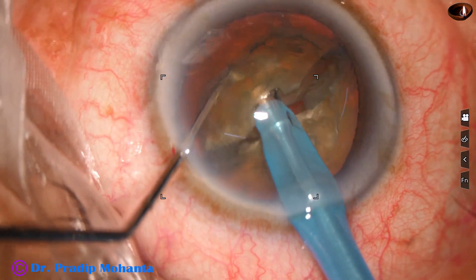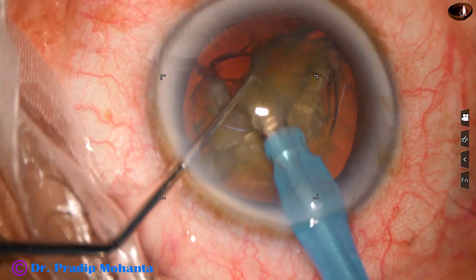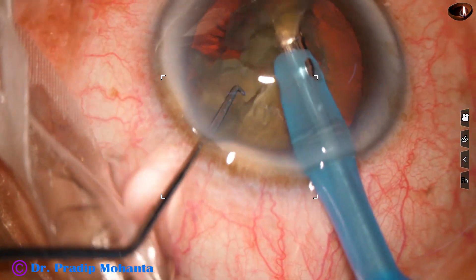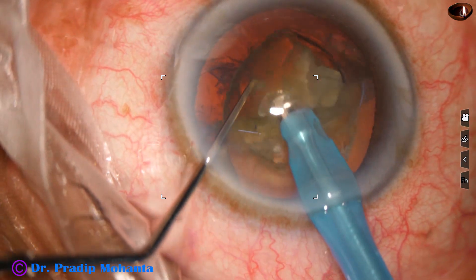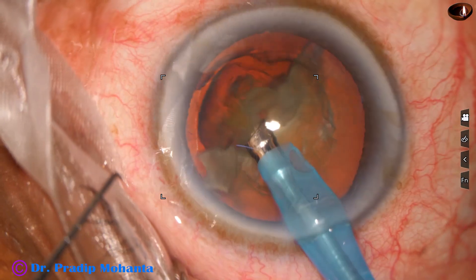One heminucleus is held and divided into two pieces, and the free nuclear pieces are emulsified with ultrasonic energy — in this case about 70 percent. Flow rate is 40 and vacuum is 400 millimeters of mercury. The free nuclear pieces are emulsified and consumed.